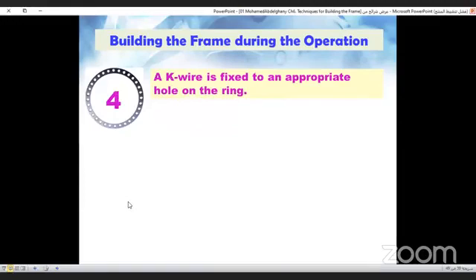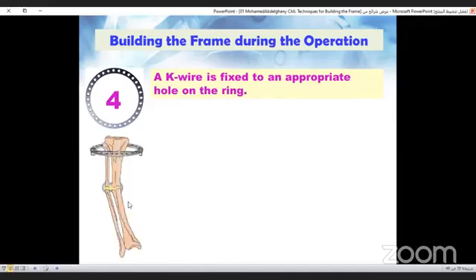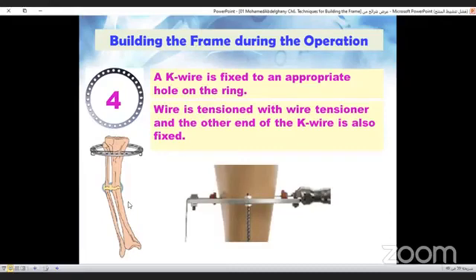Step four, fix the key wire to the appropriate hole in the ring and tighten the far end initially. Then tension the wire and tighten the near end of the key wire too.